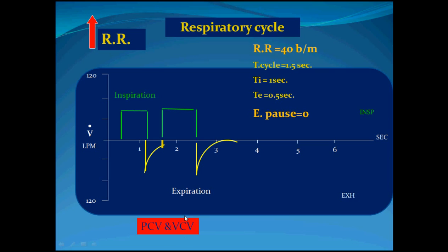But on the contrary, in volume controlled ventilation, you know that the preset tidal volume will be delivered, no questions about the level of this tidal volume. So the tidal volume will be delivered with an increase in the PEEP, with concomitant increase in the plateau pressures, and this will lead to rupture of the lung, pneumothorax and tension pneumothorax. This should be considered.